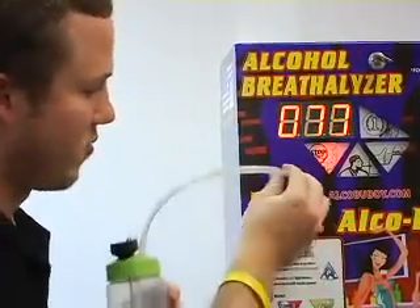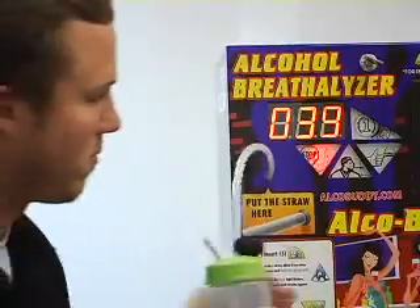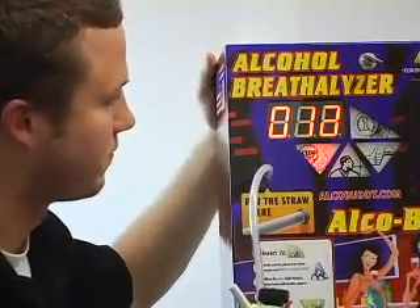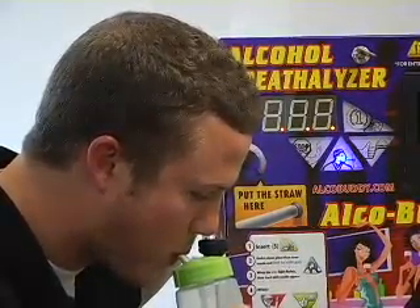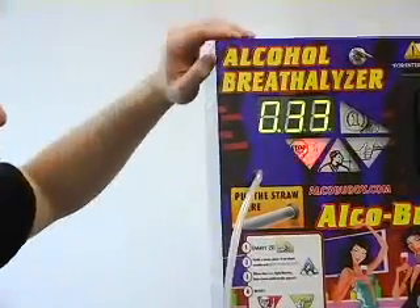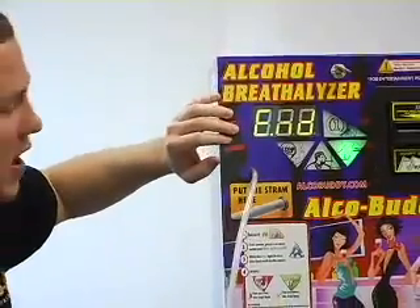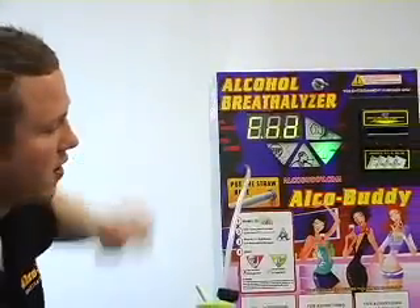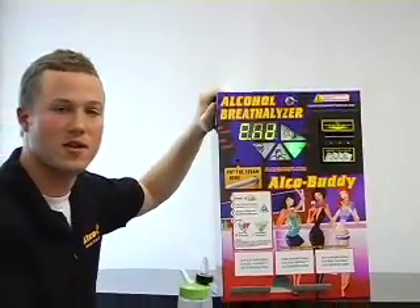We'll wait for the next 10-second countdown, hook up the tube, and get ready to blow. As you can see, we hit our range — 0.33. It flashes green and also shows 'end,' which means it's saved. Now the machine is calibrated and ready to go.